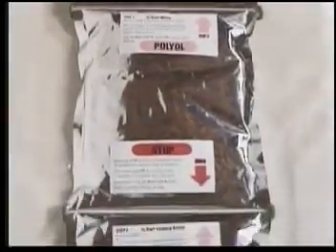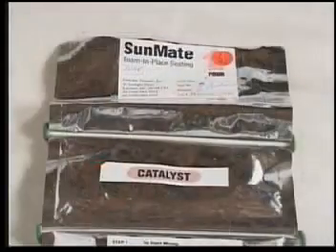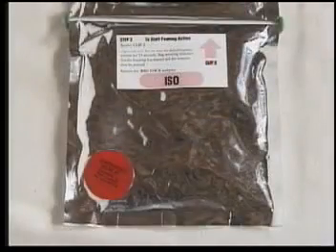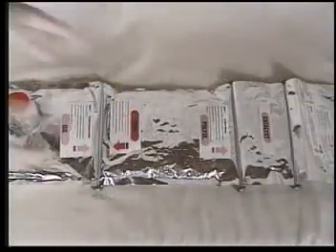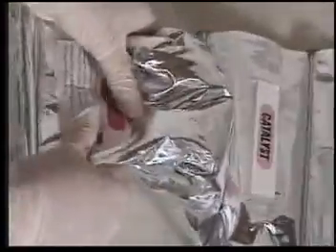Notice that the bag mix pack has 3 compartments, each containing pre-measured quantities of catalyst, polyol, or iso. Each ingredient is labeled and isolated by a plastic clip lock. To begin mixing, first massage or shake the polyol portion of the bag for at least 2 minutes to redissolve any sedimentation. Remove the lock between the polyol and the catalyst. It's important to always hold the bag locks while mixing. This keeps the locks from accidentally coming loose and prevents accidental spills.